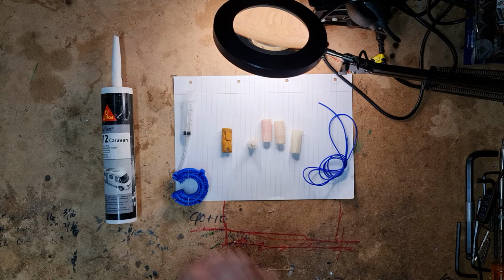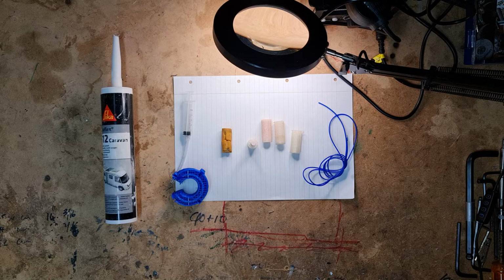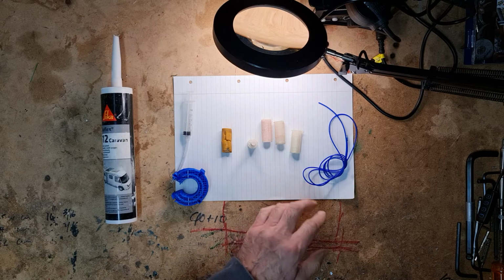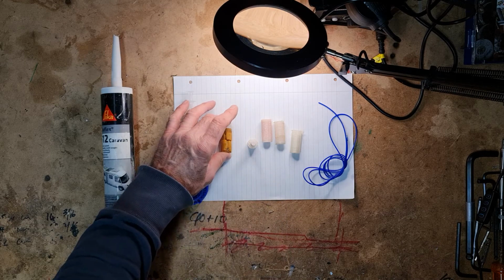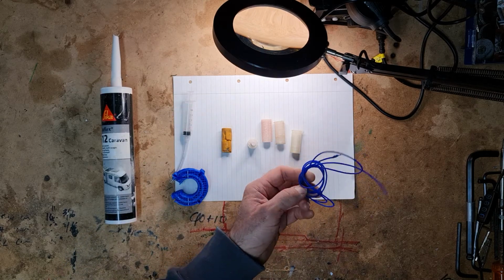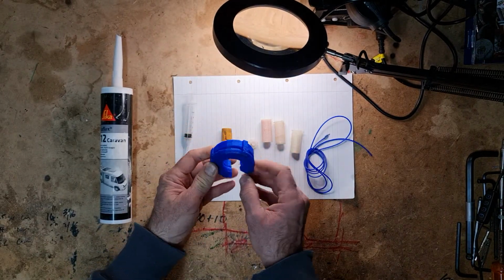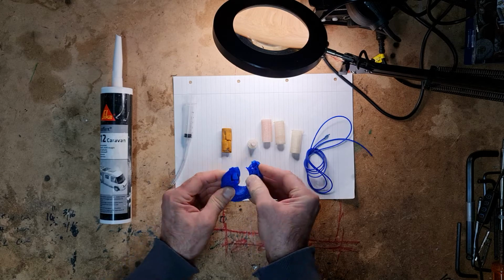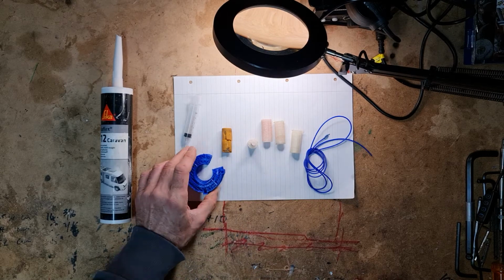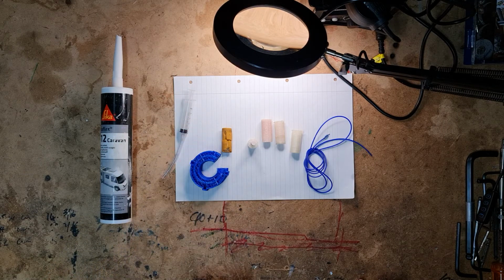So what I decided to do was to experiment and see whether I could put in a better suspension principle instead of this, but within this size unit. So what I've done is I've experimented on my printer with various plastics and other materials. Eventually, to replace this, I went for Ninjaflex TPU because it's nice and flexible. This stuff is really good. I use this a lot, so you can see I've done some experimental tries there with that. So that was definitely going to be the material to use because it gives strength plus flexibility.